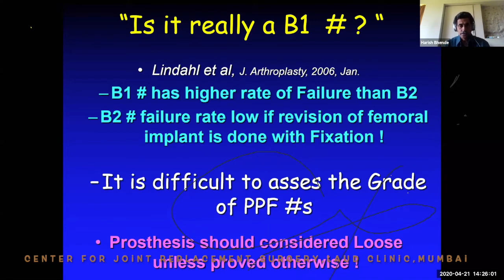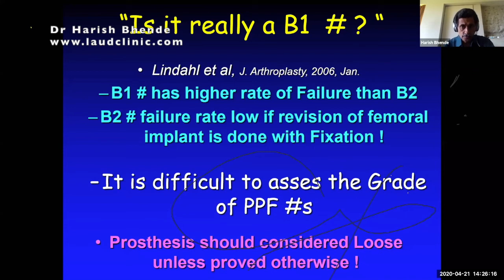So when you go for operation, you must make sure that you don't go with the preparation for fracture fixation only, but you must also keep a full-fledged revision system ready, because on table you never know when you realize that this particular case will require a full-fledged revision and just a fixation may not be adequate.